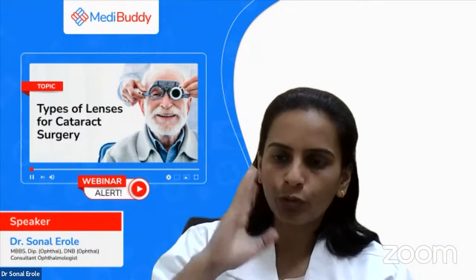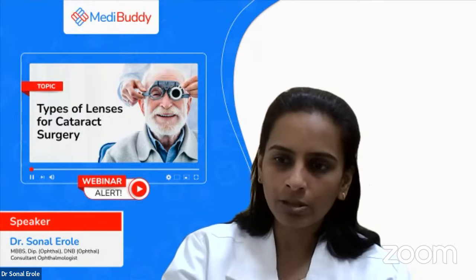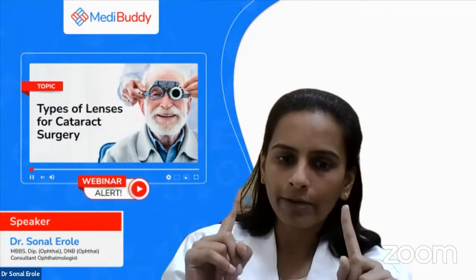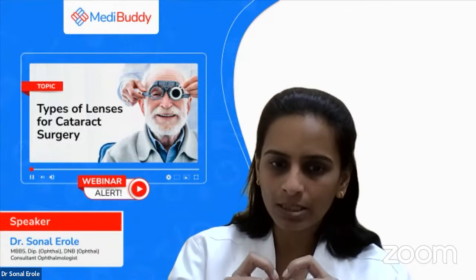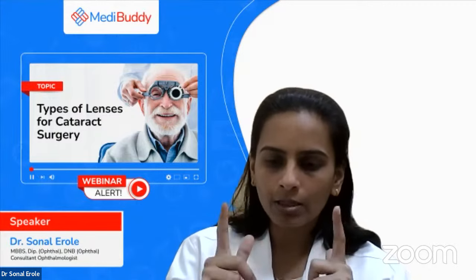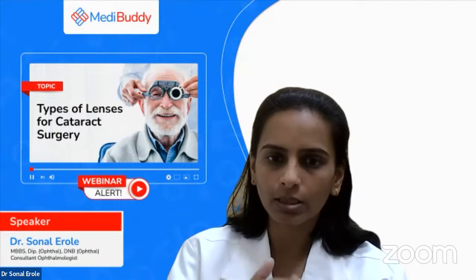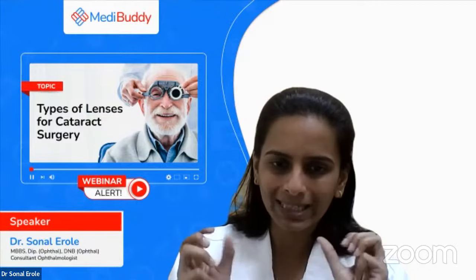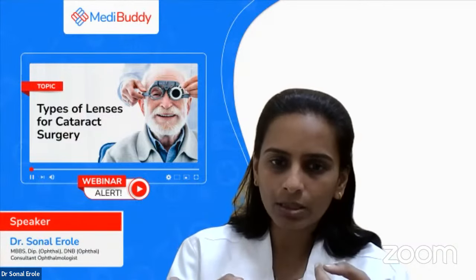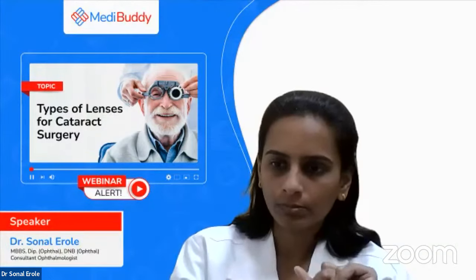If you are putting a monofocal in one eye and a multifocal in the other, they can also read for near vision, but it will not be as good as when you have multifocal lenses in both eyes. Depth perception is something done with both eyes, and it does not involve just your lens. It involves your eye muscles and very complex things in the eye. So if you have the same lenses in both eyes, then definitely results will be better. That's the thing.